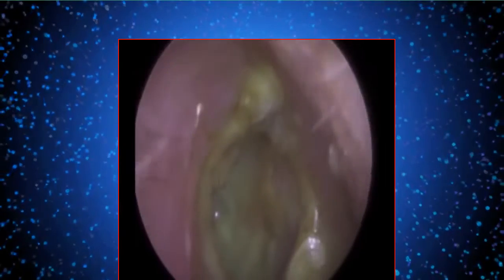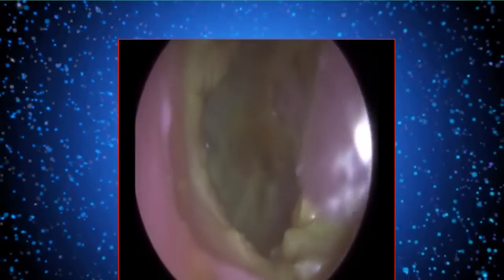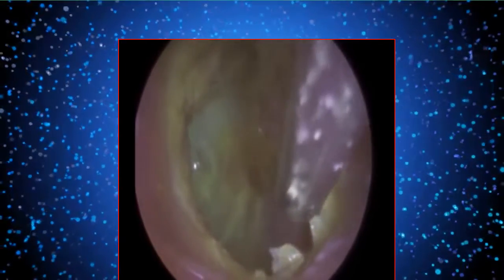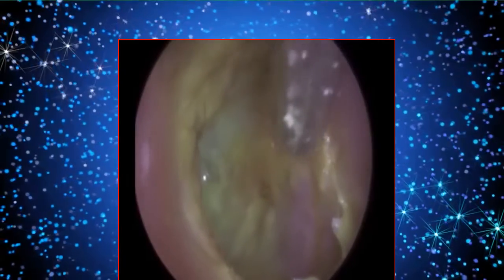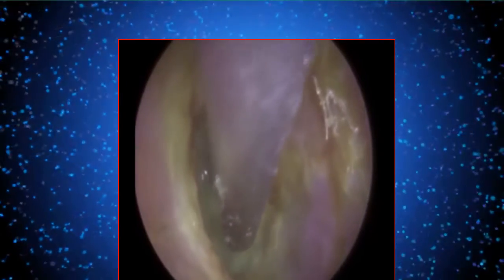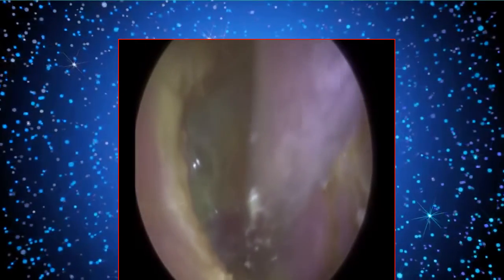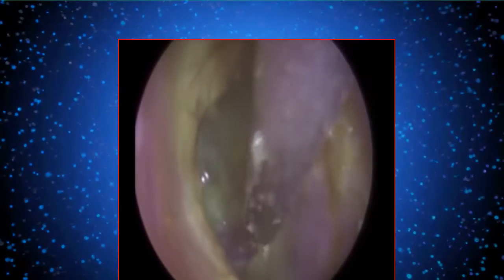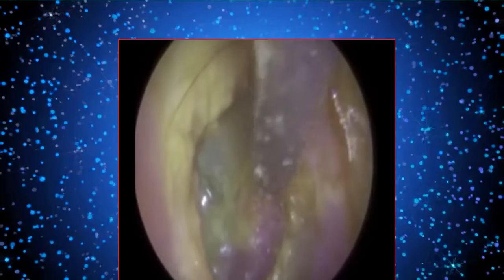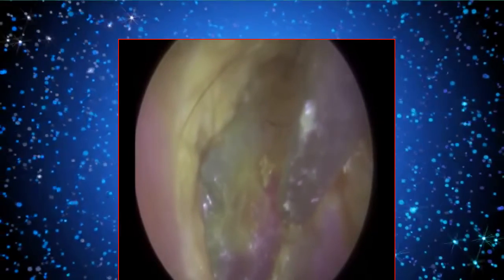So you can see, again, this ear canal wasn't as swollen as the left side last week. It was still swollen, so it's still swollen today, but not as badly as it was last week. Out of the two ears, this is the less swollen. He's just got discharge and infected dead skin right on the eardrum. We have to peel this off. Not a lot of people really enjoy the skin peels, especially off the eardrum, and more so when they're infected.